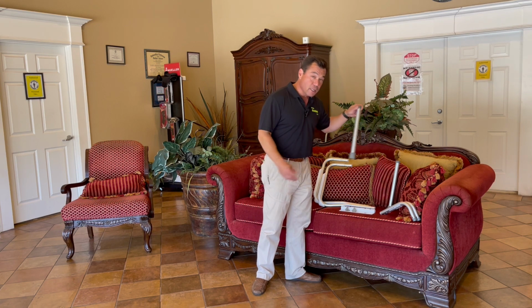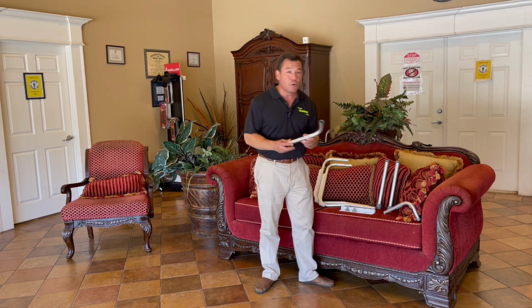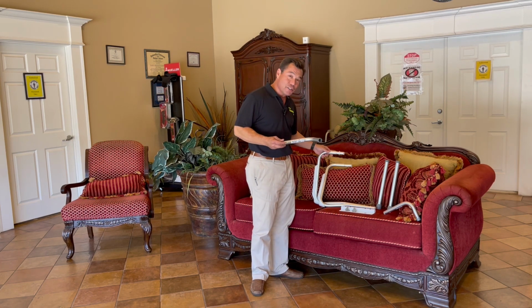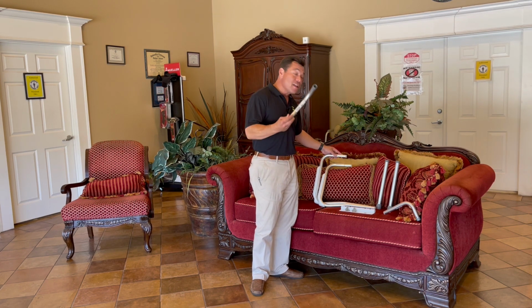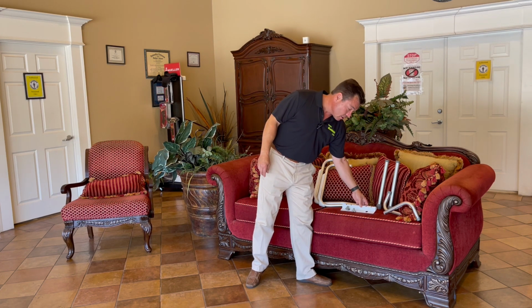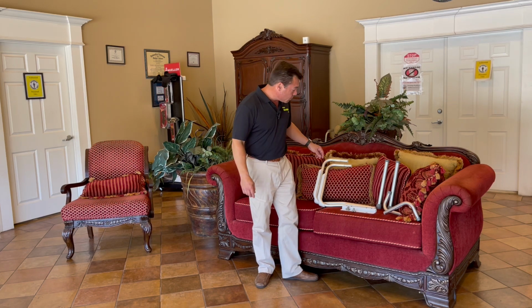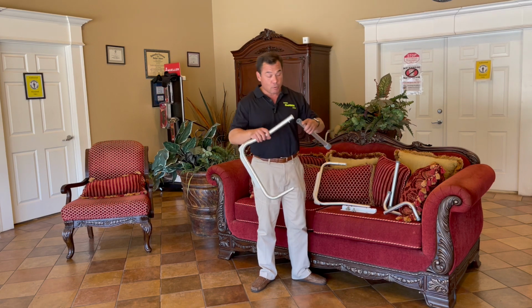You're going to get 2 legs, which will go on the front side, and then you're going to get 2 arms. These are the arms that you'll put your arms on, that attach to the toilet seat. And then you're going to get the toilet seat connection as well. These are really simple to put together. They can only go in there one way.